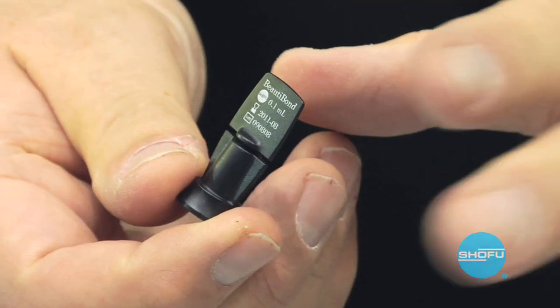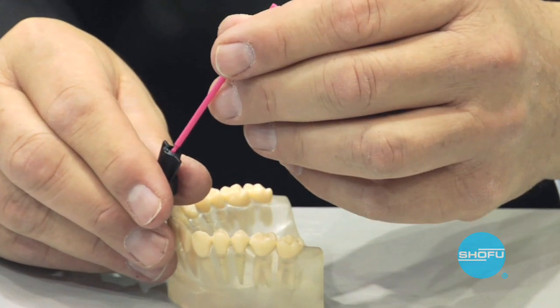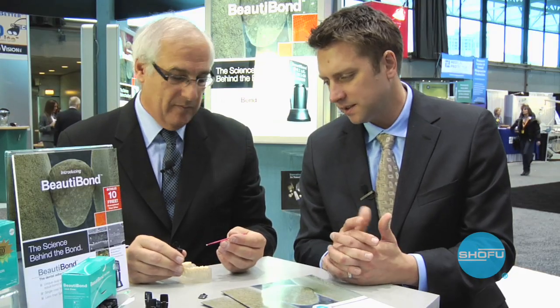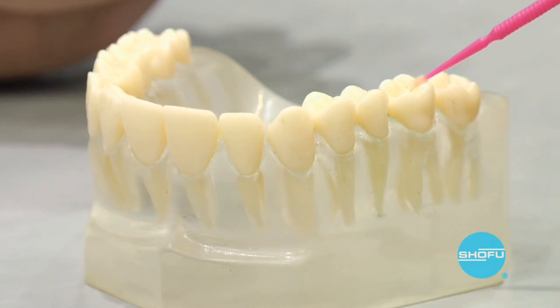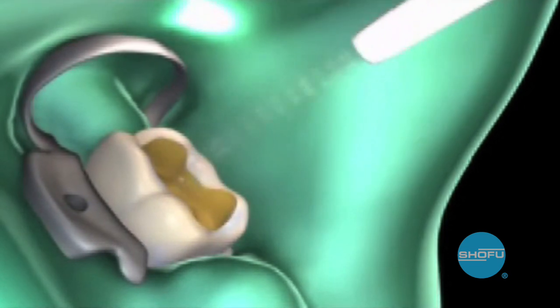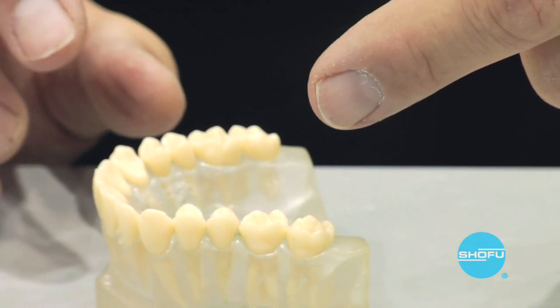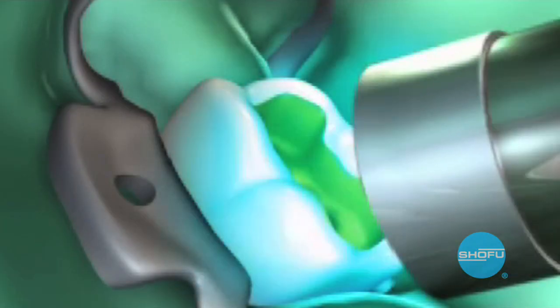So simply we're going to just open the bottle, snap off the top, pick up our brush, dip it in. So far we're the same as every other system. Now I'm simply going to apply it to the tooth, to the cavity prep. I'm going to put down my brush after just one simple application. I'm going to take my air syringe and come from outside, which is a soft air, and move towards the restoration so that I get a harder stream of air, if you will. And this will all take about 5 seconds. Then I'm going to photocure for 10 seconds and I'm finished. So basically, application, blow some air on it, and then light cure it. Photocure and apply your composite.